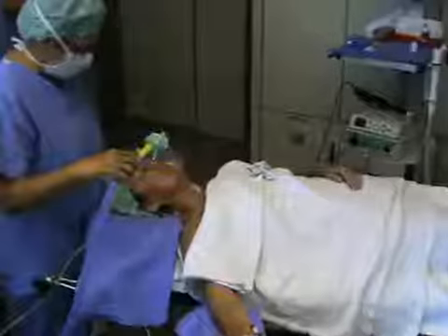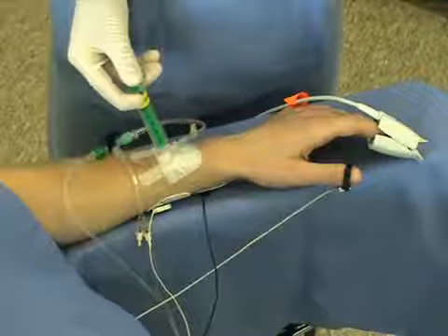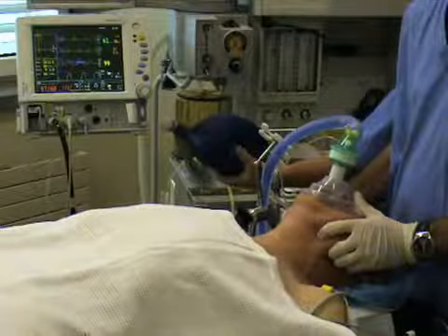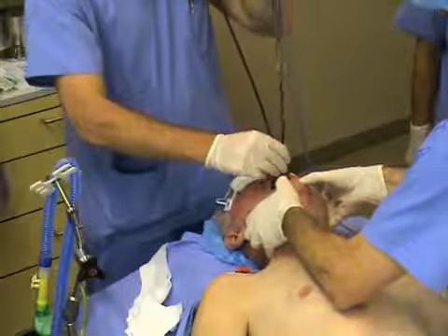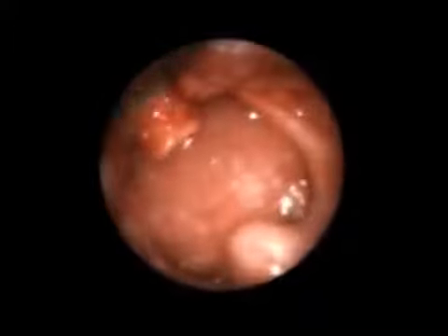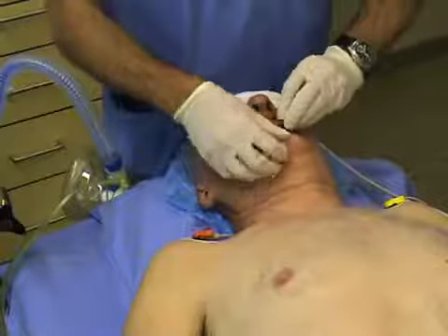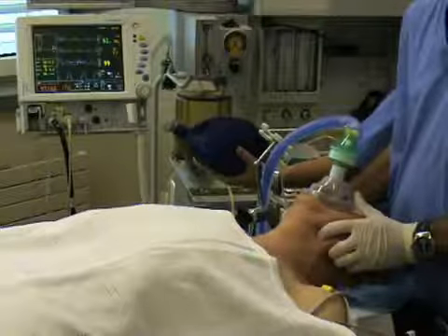Lack of patient cooperation precludes using an awake technique even in situations in which airway management is expected to be difficult. In such patients, general anesthesia should be induced only by experienced anesthesiologists. Oral fiber optic intubation is indicated in the management of an unanticipated difficult laryngoscopy in the already anesthetized patient, provided that mask ventilation and therefore oxygenation are possible until fiber optic intubation may be performed.